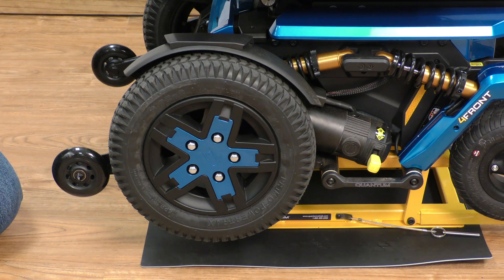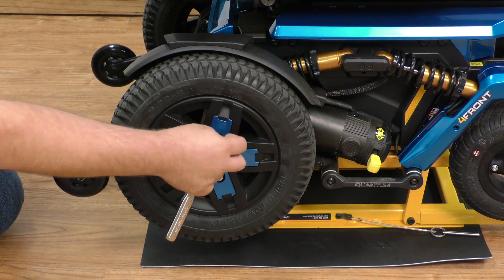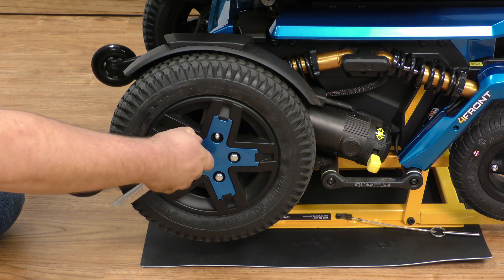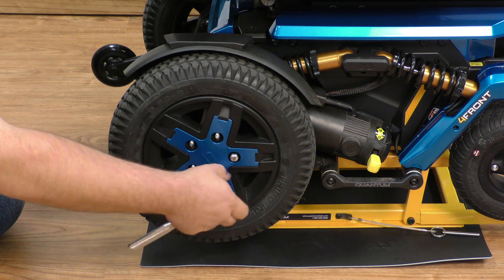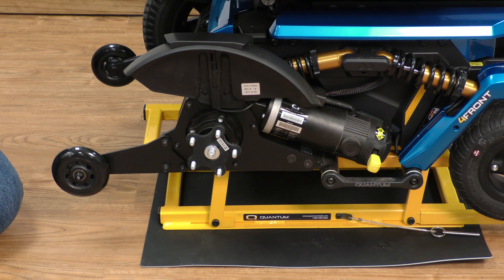Today we're going to demonstrate the removal of the front strut on the power chair. First thing you want to do is remove the five lug nuts that hold the drive wheel onto the motor. Now we remove our drive wheel.